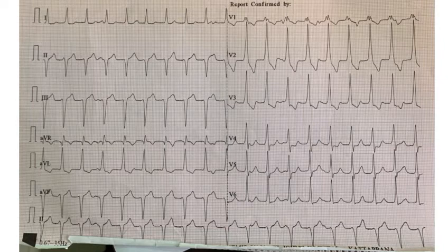What did he say? Sir, accelerated idioventricular rhythm. What is happening to the QRS complex? Sir, left posterior fascicular tachycardia. It will be VT, sir, first of all, because it is broad complex. What is happening to P and QRS complex? Is there an AV dissociation? AV dissociation present, sir. Yeah, there is an AV dissociation.